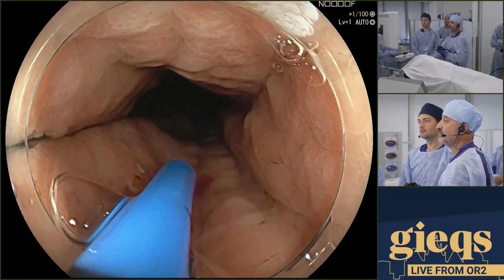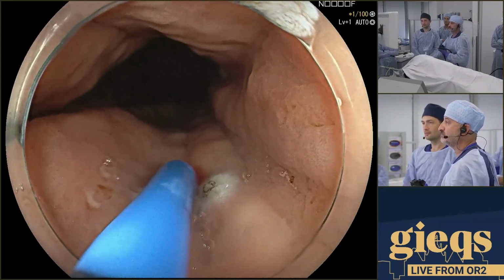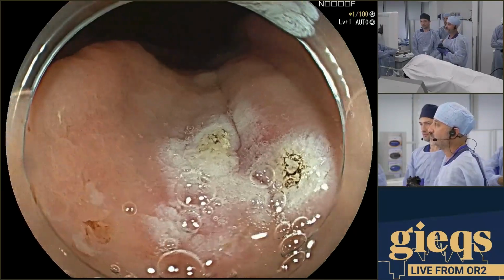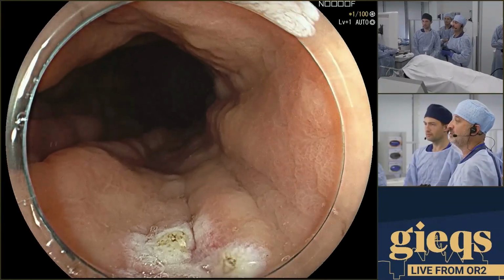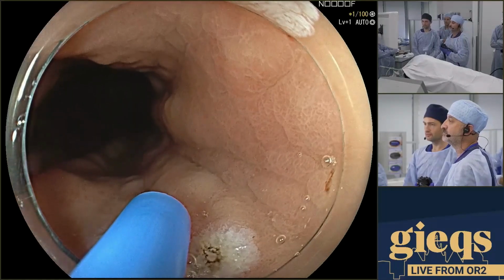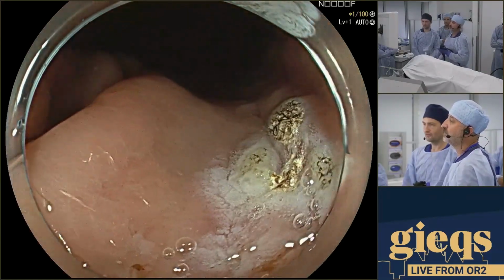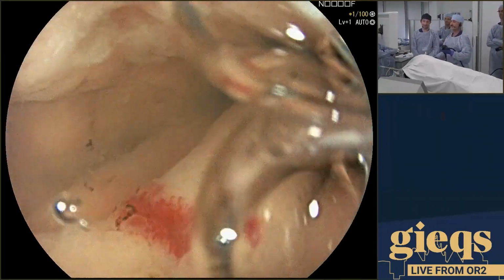And let's see if we can burn without making it bleed. You happy, David? Maybe a little bit more on the right upper side? I think we can do that. But you want to get this sort of golden brown appearance. Very nice so far. Nice. All right, I'm happy with it. Now I'm very happy. It's all about your happiness.